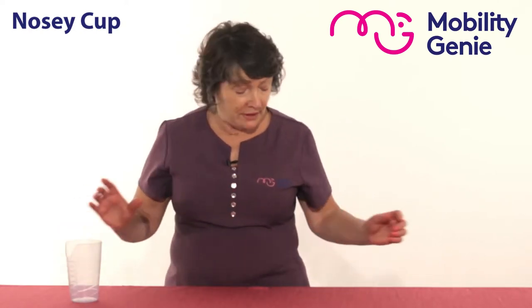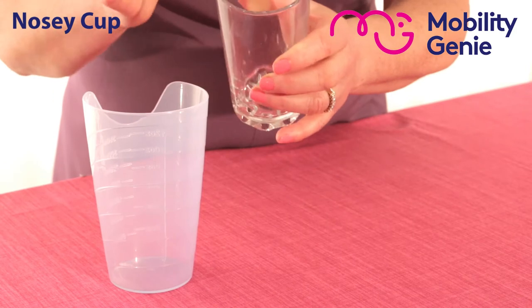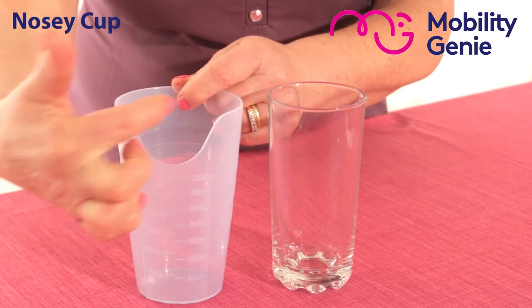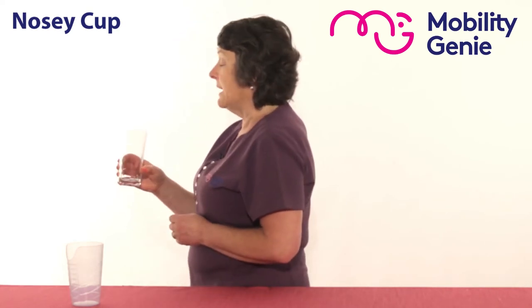For example, I'll bring an ordinary glass and we'll compare the two. So with the ordinary glass, it's all the same height, and with the nosy cup, it has one part scooped out here to allow room for the nose. So I'll show you now what it looks like when I'm trying to drink from an ordinary glass.